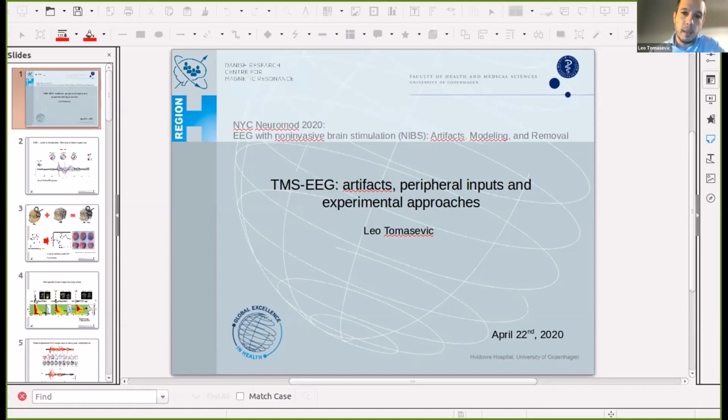And this is how TMS-EEG is actually studied, where a TMS pulse is given at certain time points and recorded with EEG. After many trials, we average them and we get the time evoked response, which is similar to the standard method when we do any kind of EEG event stimulation protocol. The big difference here is that TMS as such is a noisy device because it produces a big magnetic pulse that affects the EEG channels. It produces other effects that I will talk about later.